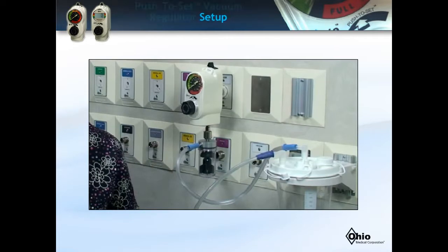We will now demonstrate the proper setup using an analog gauge push-to-set vacuum regulator, an overflow safety trap, and suction canister. The setup process will not vary for a digital gauge push-to-set regulator.